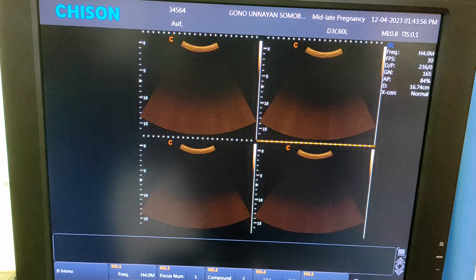Click one point here and also point here, then press enter. Now select AC, or abdominal circumference. Click one point here and move it lower here, and press enter. Now rotate your mouse button — see, this shows the expected fetal weight: 410 grams.